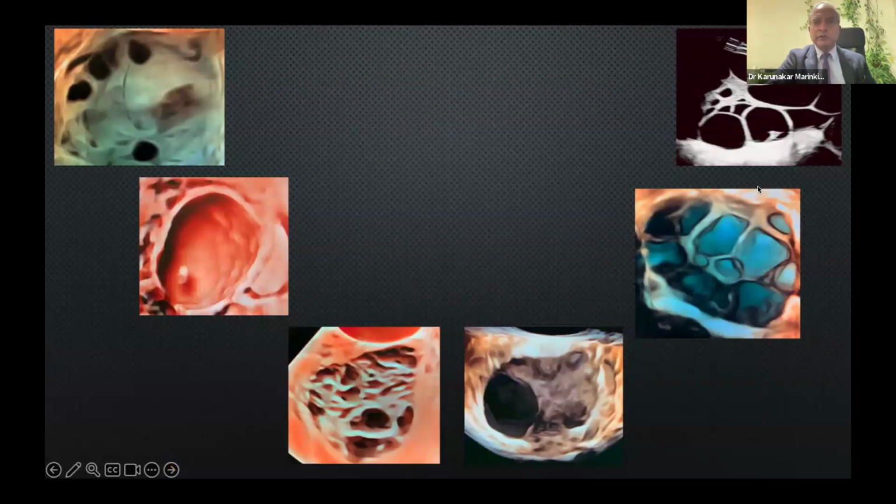You should know what the normal variations of the ovary look like. This is a spontaneous ovarian hyperstimulation syndrome. In a natural pregnancy, I saw. That's why I just put it there, because the HCG of the baby or the placenta can cause hyperstimulation in very hypersensitive ovaries. This is the cumulus oocyte complex. This is the cribriform form of corpus luteal hematoma. This is organizing corpus luteal hematoma.